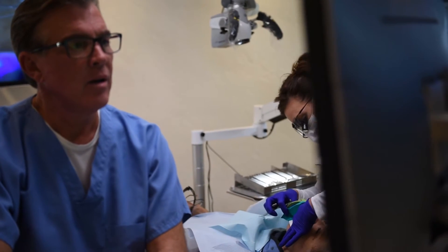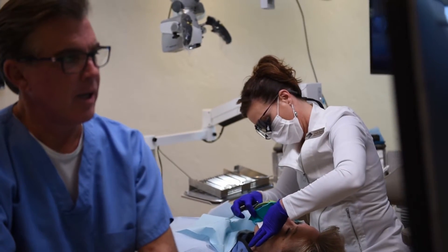Before, it was a random walk that required hundreds and hundreds of root canals to be treated before you had a sampling of the kind of anatomy you might encounter in a patient. Now we can do it in much less time because we control the anatomy and because you can do iterative training.